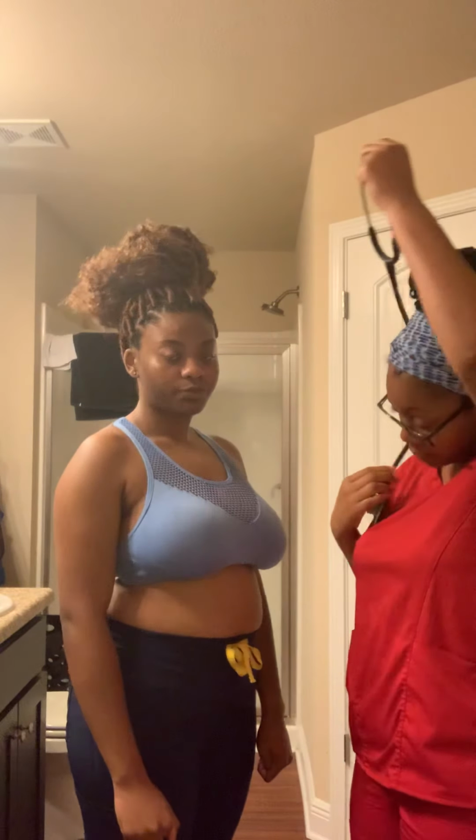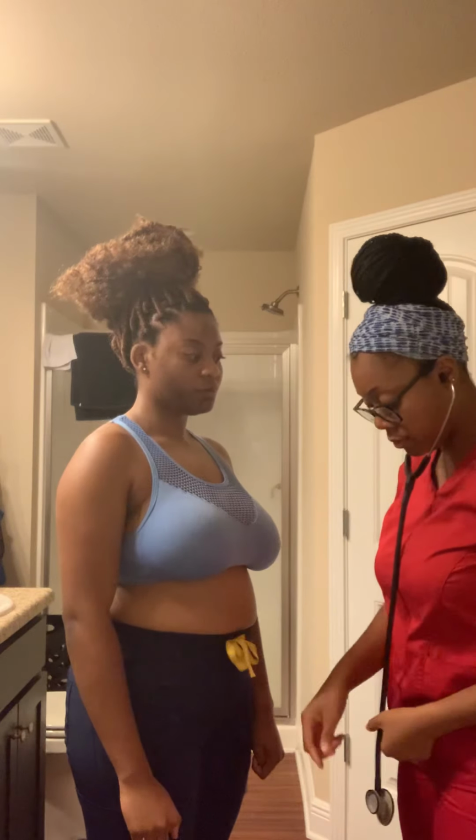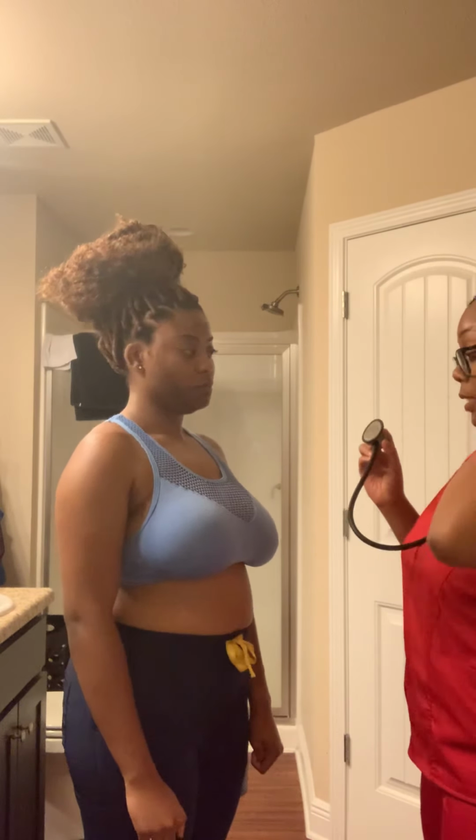So now what I'm going to do is auscultate the respiration sounds by using my stethoscope. I will need you to breathe through your mouth, and I will need you to take deep breaths, and this may go pretty fast.